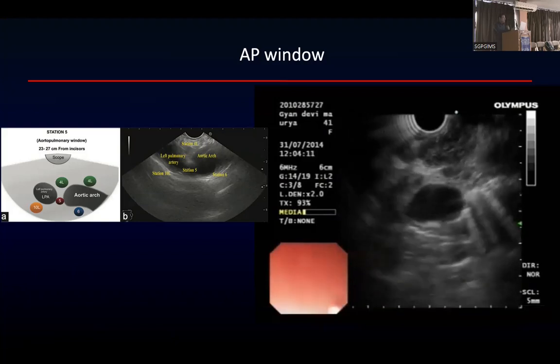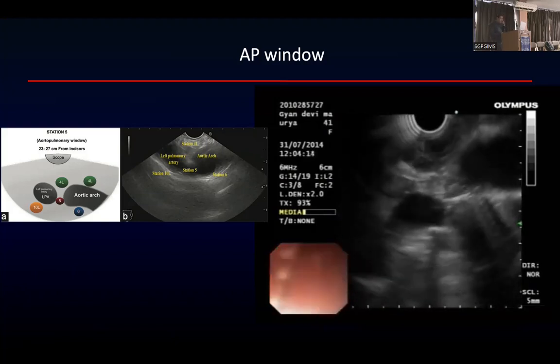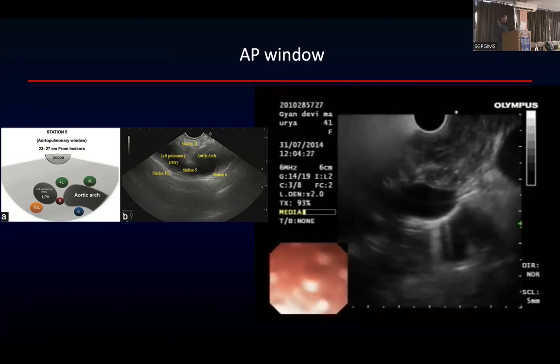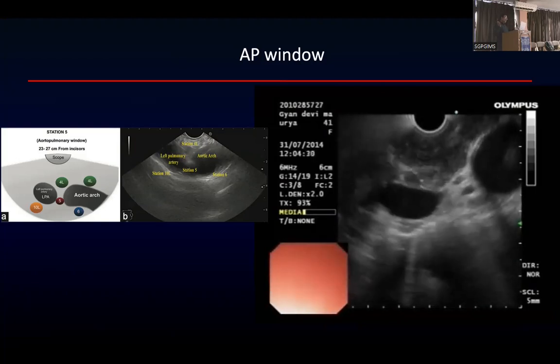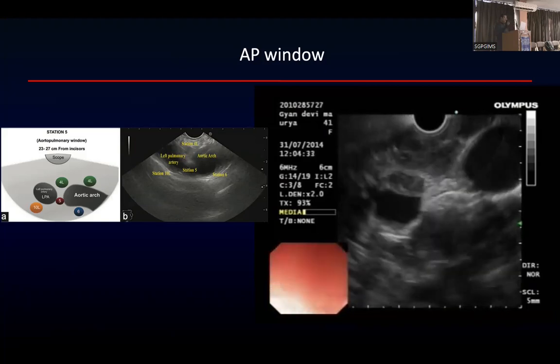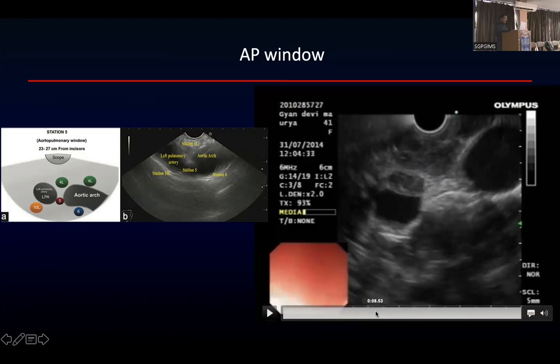Just see this. This again patient who had obviously lymphadenopathy. So you can see right side में aortic arch आ रही है, left side में pulmonary artery आ रही है. अब मैं इसको position कर रहा हूँ. ये large lymph node AP window में है आपका. Okay. So here if you see 4L, 5.